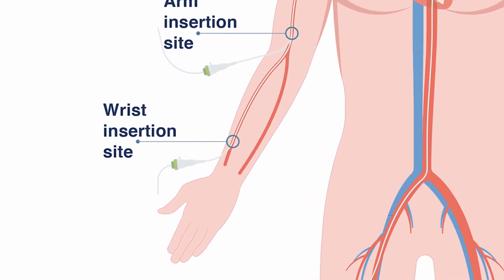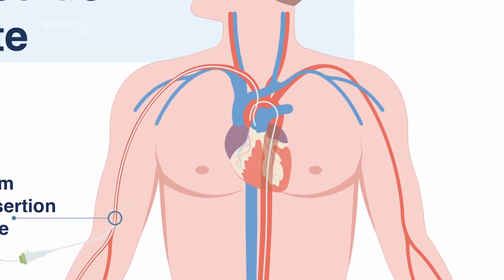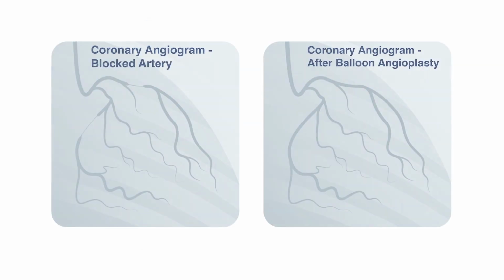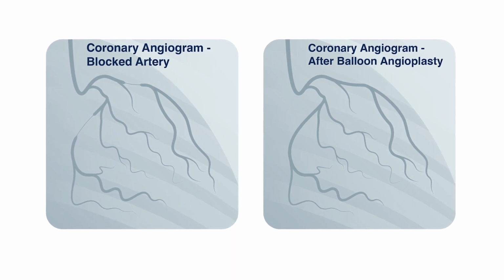So a catheter is taken into the heart, and the arteries are found, and they are injected with iodine-based contrast dye, and an X-ray picture is taken like a video clip, and we see the flow of that through opacification of the X-ray iodine-based contrast dye medium that we use. The idea is to create a picture or skeleton of how that artery looks, and we can see through that whether there are narrowings within the heart arteries that may need to be addressed based on the severity that we deem we're seeing visually.